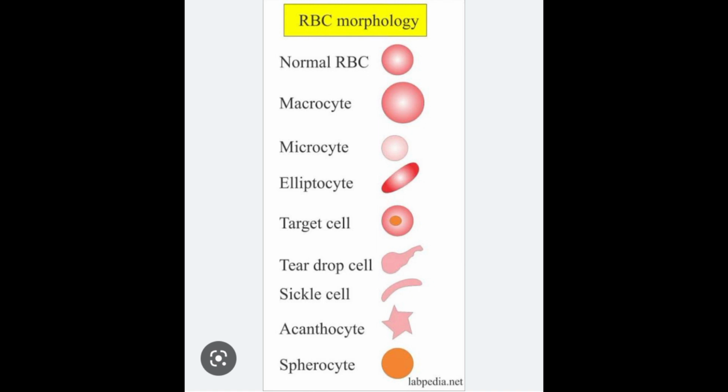Clinical significance: the abnormal morphology of RBC must be reported along with the peripheral blood smear. This is helpful in the diagnosis of various types of anemia and other diseases like malaria and thalassemia. The following types of abnormalities are seen with the RBC. Color reactions: the hypochromic RBC.